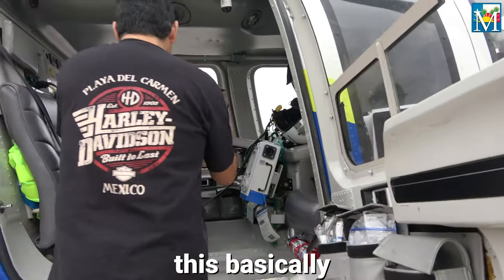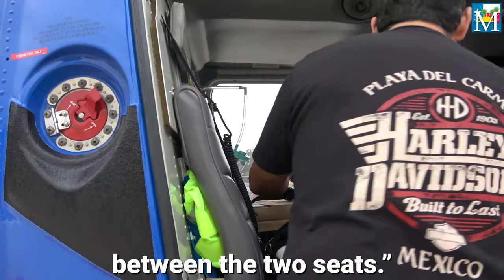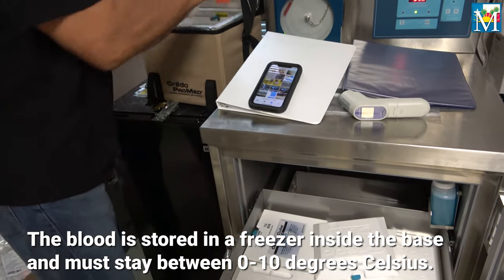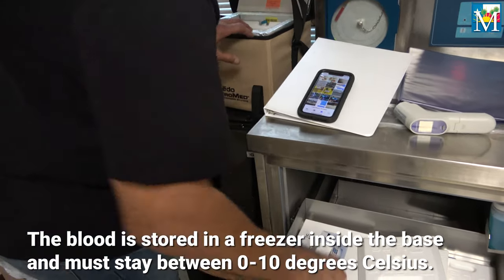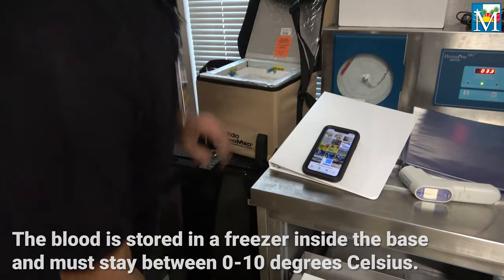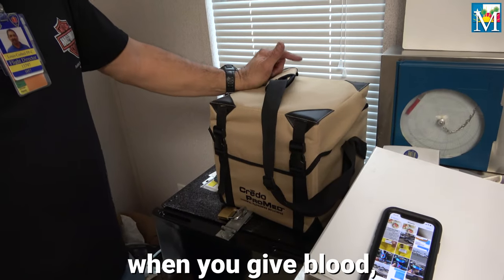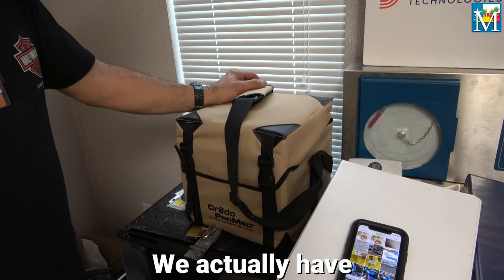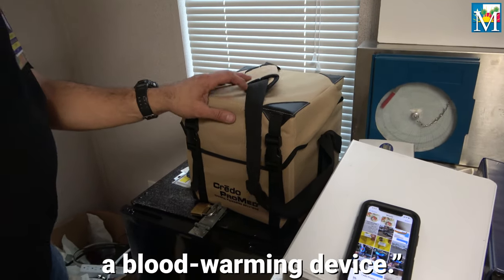So when we get a call, this basically goes right here in the middle, between the two seats. Because the blood is cold, when you give blood, you don't give it cold. We actually have a blood warming device.